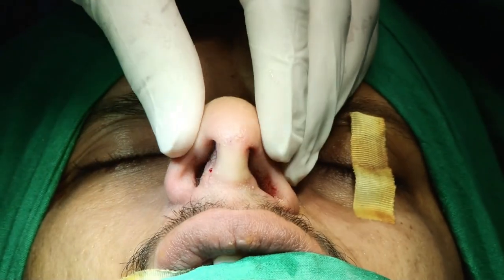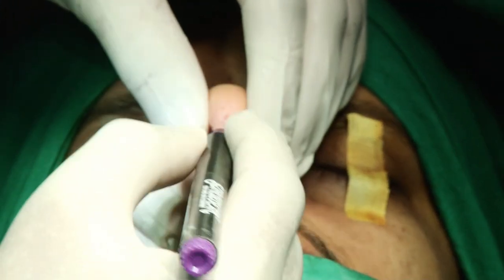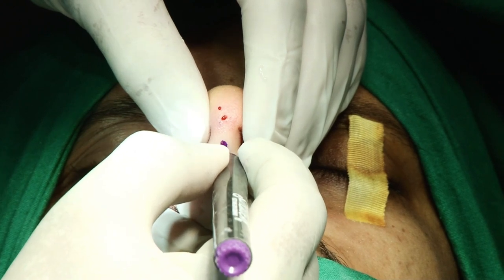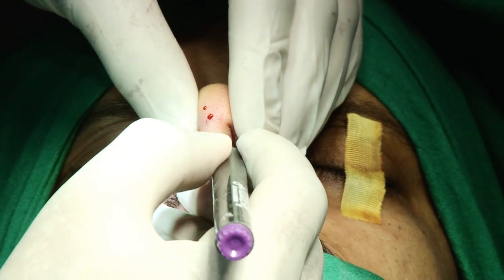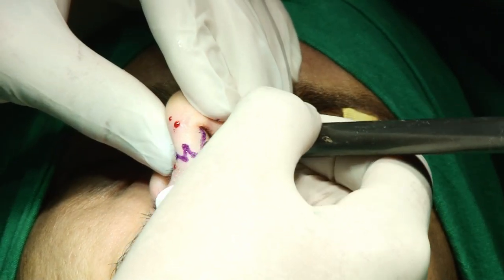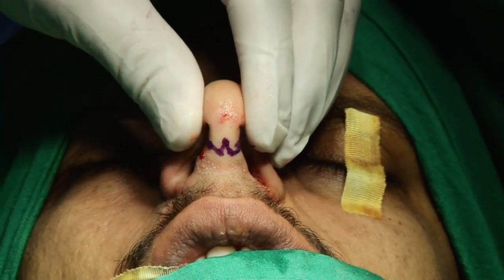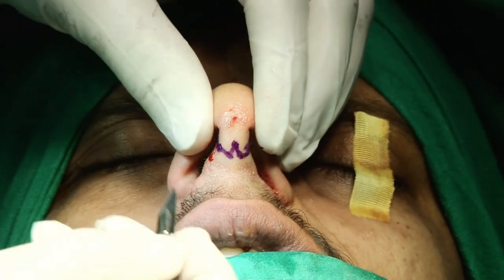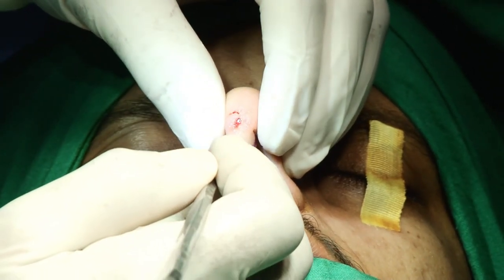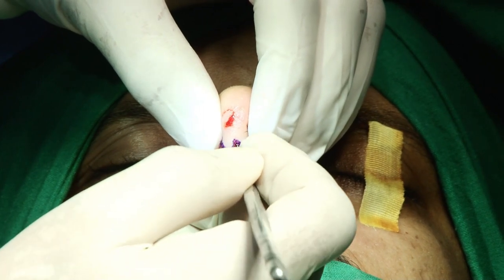So you hold your tip lobule between the index finger and the thumb, and then you mark the classic inverted V incision, and a type of W incision on this side. Now how do we make the inverted V incision? I usually use the number 11 blade, hold the columella like that, and go perpendicular, just a straight incision.